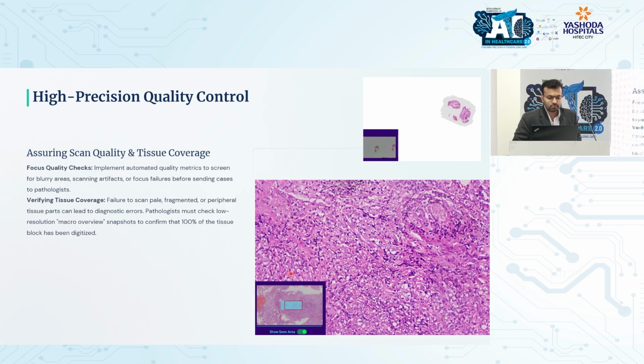What you see here shows you how much area you have scanned. When you have a microscope, you have a box, you can draw a box around your section and go in a zigzag manner. But in a scanner, it's not possible. So here, it shows you what all areas you've screened, and what is missing can be screened again.